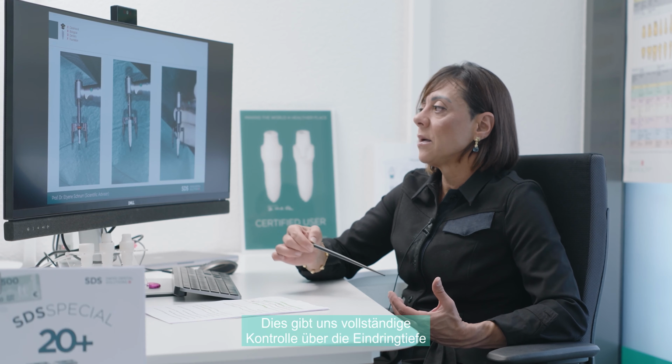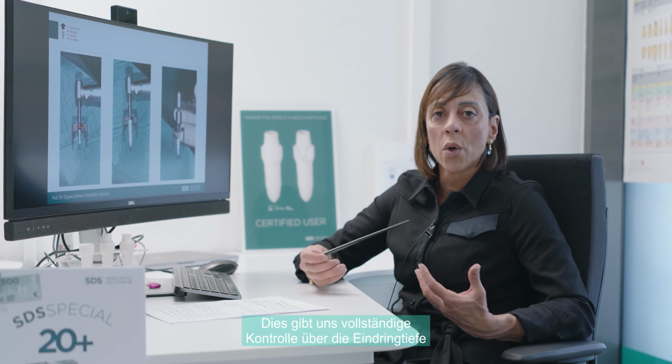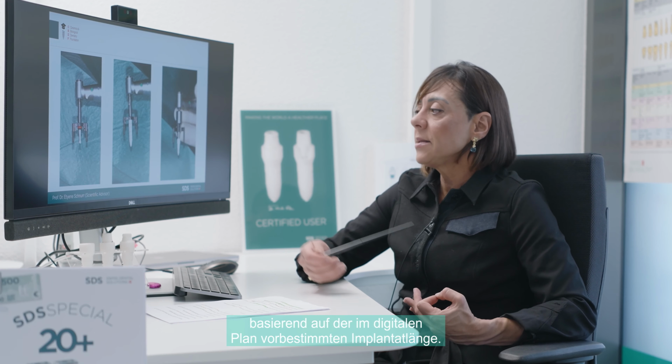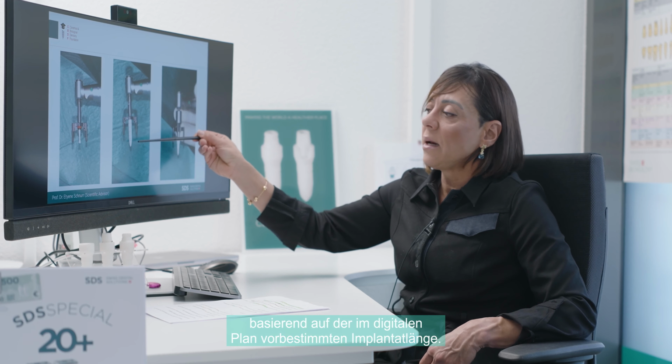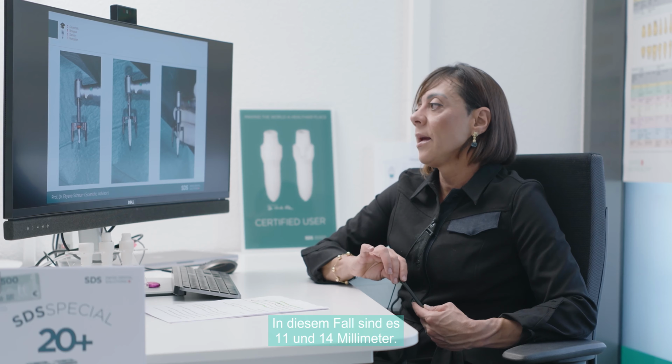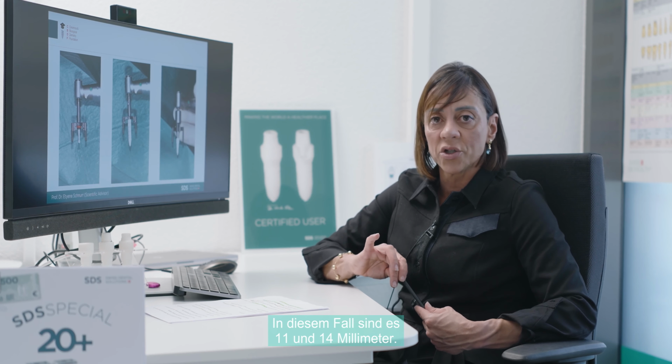This gives us complete control of the penetration depth based on the implant length predetermined in the digital plan. In this case, 11 and 14 millimeters.